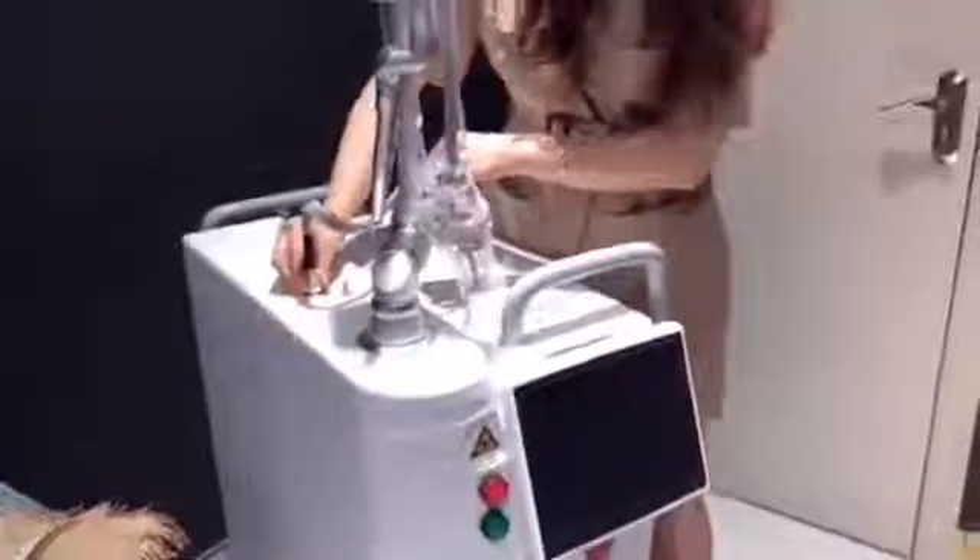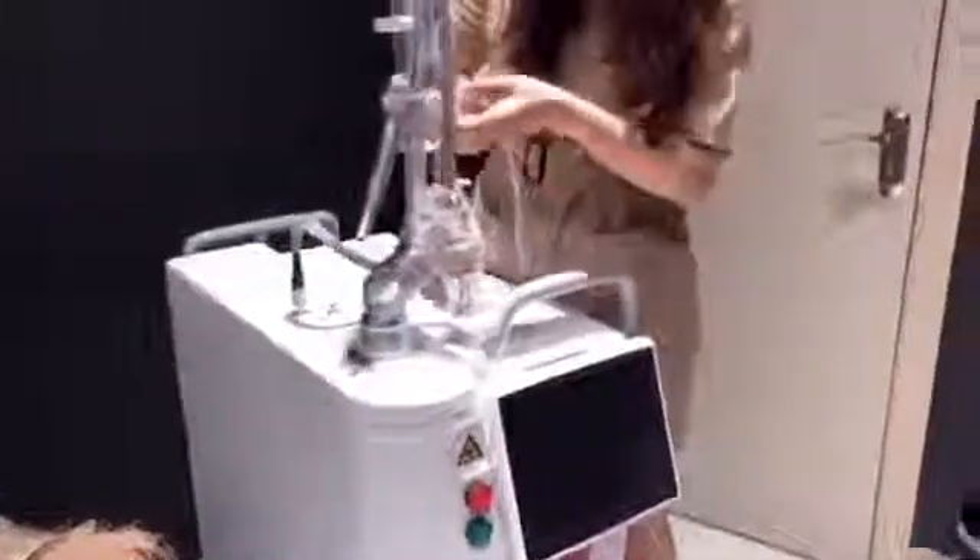Connect the fractional pipe to the machine and make it tight. There are two plastic pipes: connect the longer pipe to the machine and connect the shorter pipe to the probe.